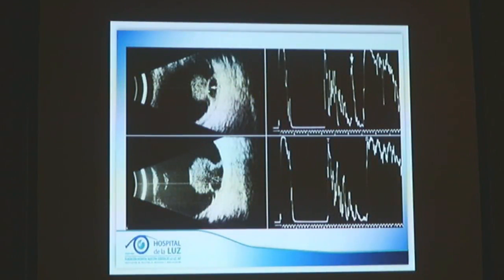es que aquí se alcanza a ver lo que es la membrana de Bruch. Si se dan cuenta, en el modo estandarizado se ve un pico de alta reflectividad que correspondería a este. Y vemos aquí la membrana de Bruch, otra reflectividad media alta que correspondería a esta membrana. Y cuando esta membrana llegara a estar totalmente falta de continuidad, o sea, rompe la membrana, no encontramos este pico en ese tipo de lesiones.